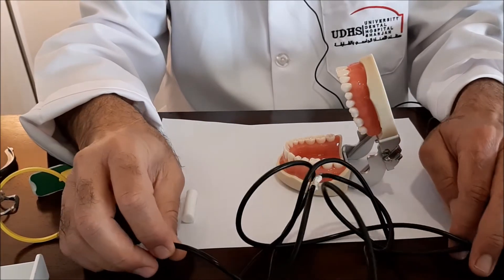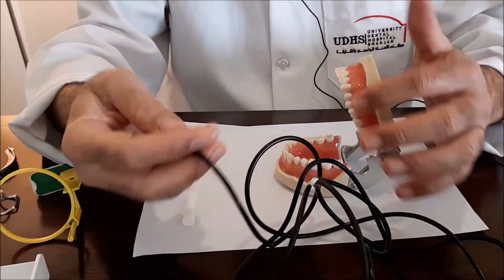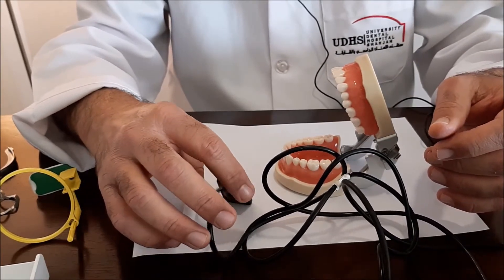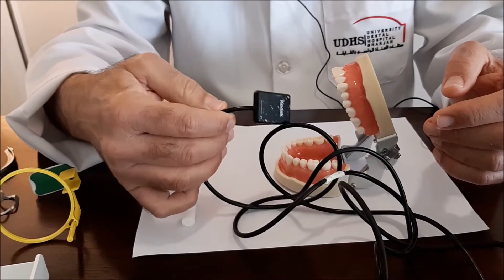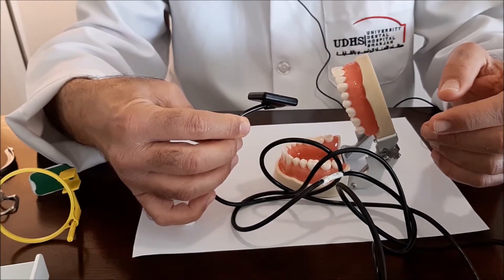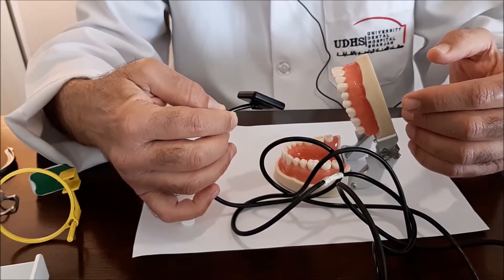Welcome everybody to this series of videos. Today we will start from the interior teeth. When we are using the sensors inside the oral cavity, there are two types of sensors. The first one is this direct type, and I'm using here size zero or size one, which is the small size. I feel it is more comfortable to use inside the oral cavity than the bigger one.